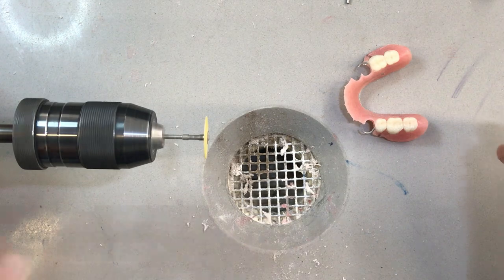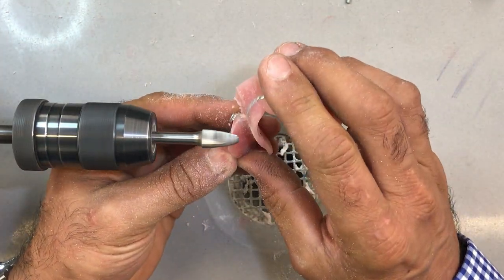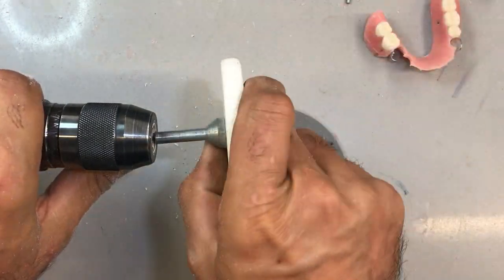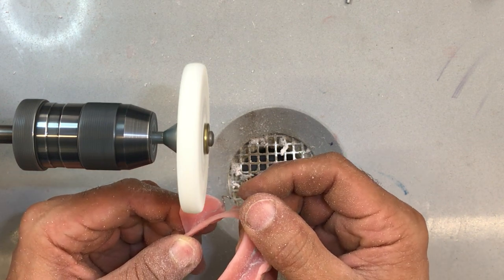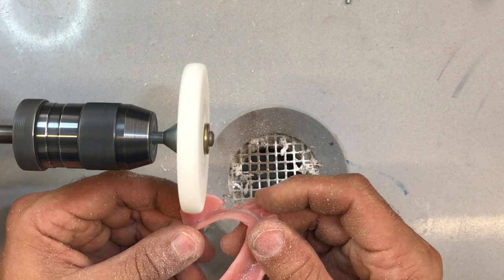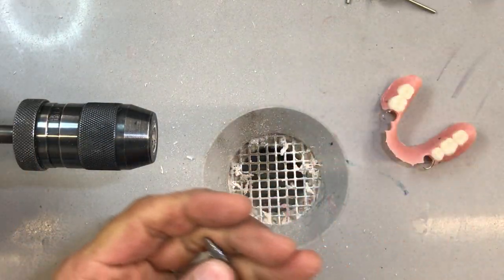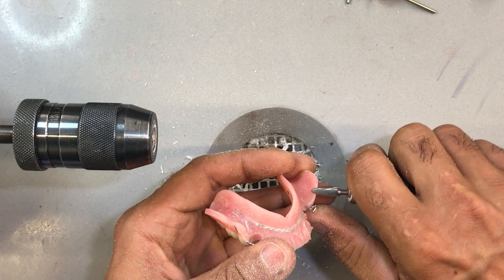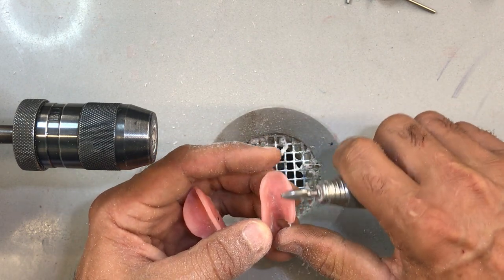Let's go back to my large taper burr. We are very close to fitting the case on the duplicate model — which is the moment of truth, so to speak. Because if you have a good duplicate and it fits the duplicate model, 99.9999% of the time it will fit the patient without any issues, providing your impression was correct.